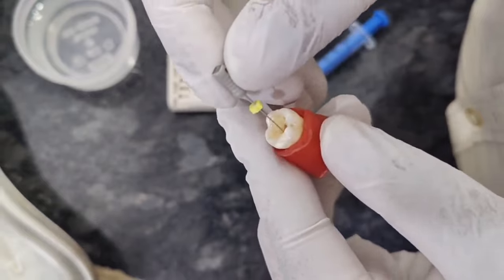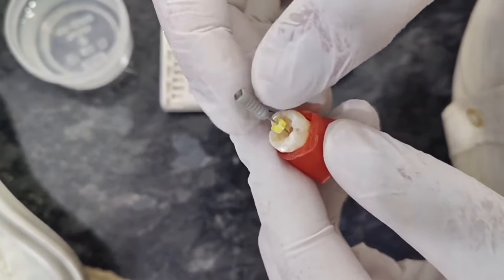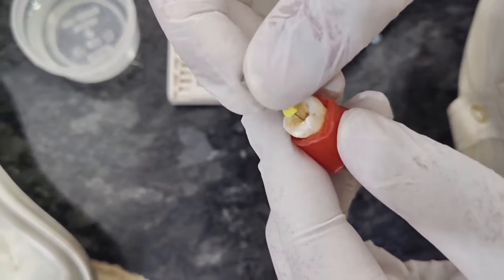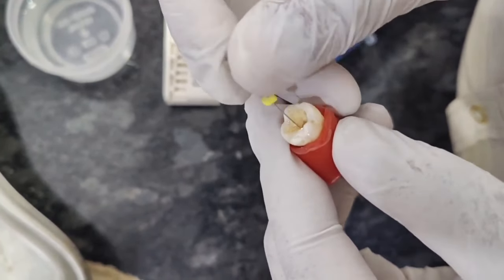Don't do like this. This is a wrong motion. Many people are doing like this. What it will do is cause ledges in the canal. So you have to be very soft with your hand. Your tactile sensation should be at your highest. And this is the way you should file it, just a little bit.